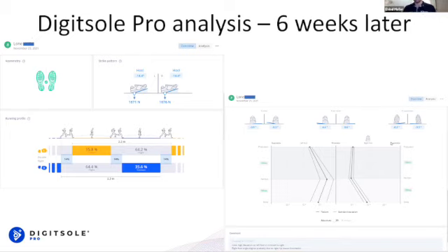It must be about having her awareness of the right hip. And of course, it can be an issue that your hip is always externally rotating and giving this kind of kinematic chain issue down to your landing. But she's as such not having any issues with it, so she has adapted very fine to it, and we should keep it on.